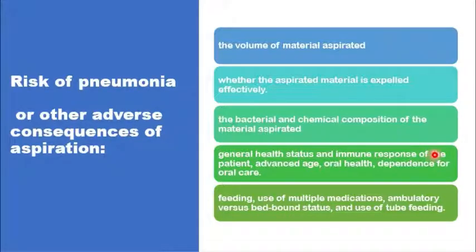So there are other factors that affect the risk of developing pneumonia other than the penetration aspiration scale, which only reflects the depth of invasion of the aspiration.